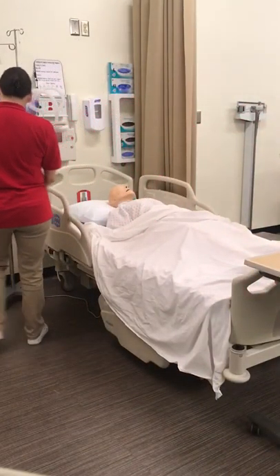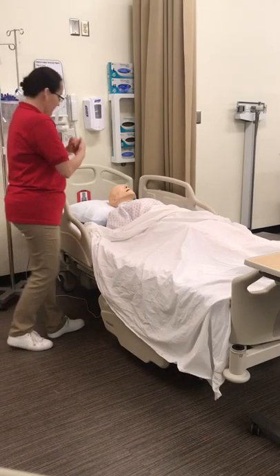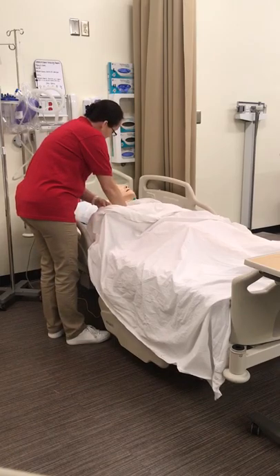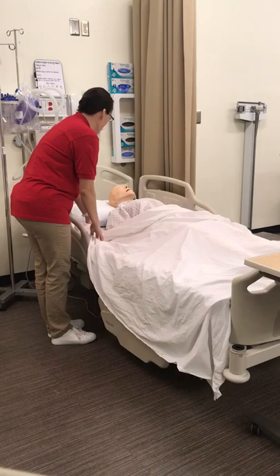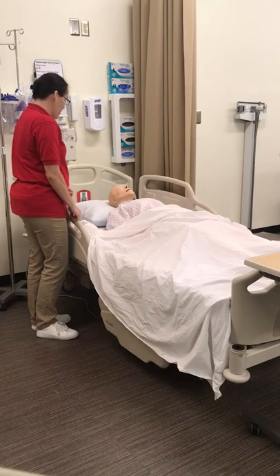Hi, Mr. Johnson. My name is Jennifer, and I'm going to be your nurse today. I'm going to wash my hands. I need to verify your ID band. What's your full name and your date of birth? I see you have an allergy band — what are your allergies? The physician has ordered a small volume enema today for you. I'm going to gather the supplies and then I'll be back to do the procedure. Do you have any questions?